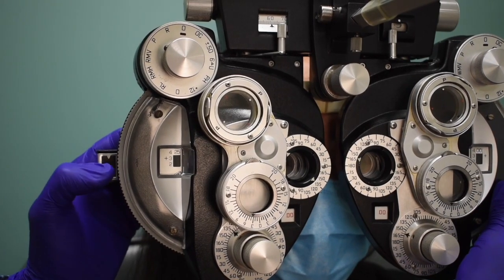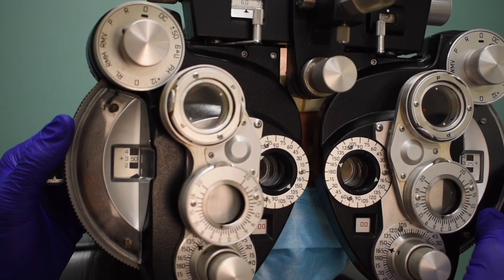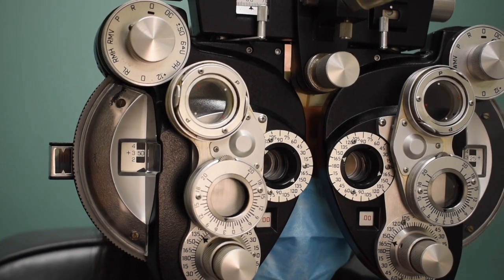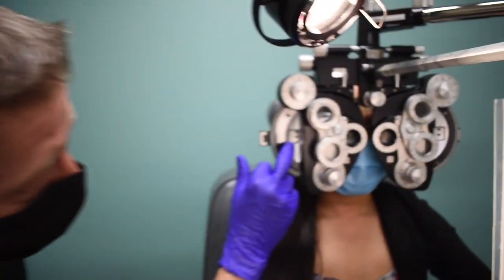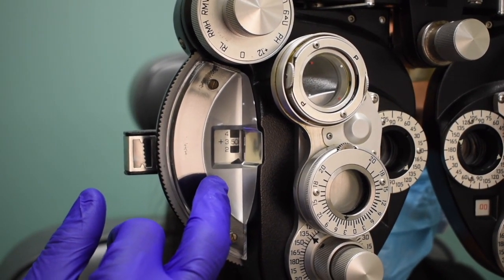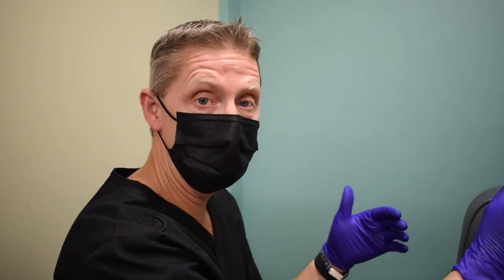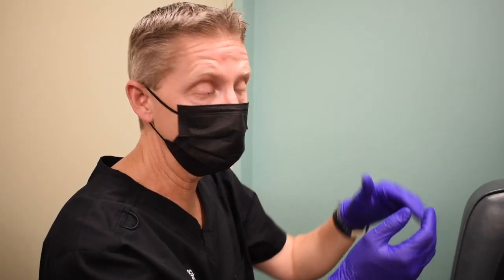We have a plus 3.75 blur out. Going two past, we ask the patient to tell us when they can read a couple of letters again. Here we have a plus 3.50 recovery. A plus 3.75 or plus 3.50 would be the gross finding. The net value is the difference between where we started and where we ended. Phoebe started at plus 0.75 on the right eye, so her net blur out was plus 3.00 and her net recovery was plus 2.75. Recording: plus 3.00 over plus 2.75 net.